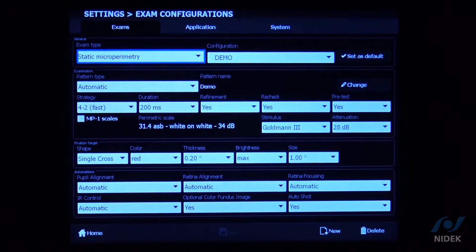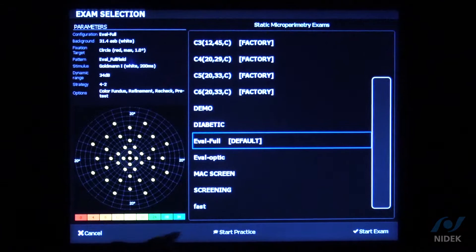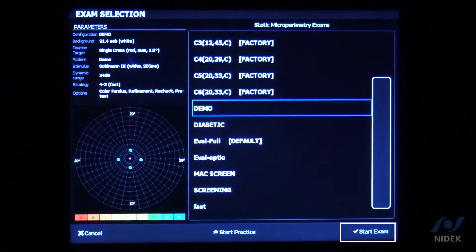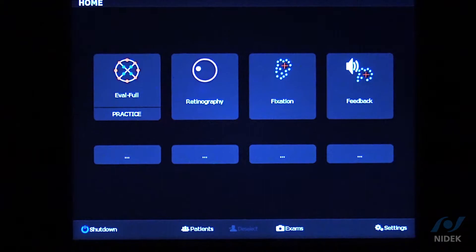Now that it has been saved, if I go back home and into my Favorites settings, you will now see that the demo pattern is there. I can select it and start my exam directly from the Favorites menu.